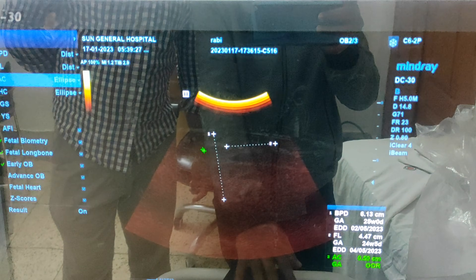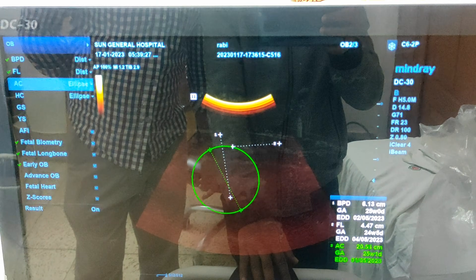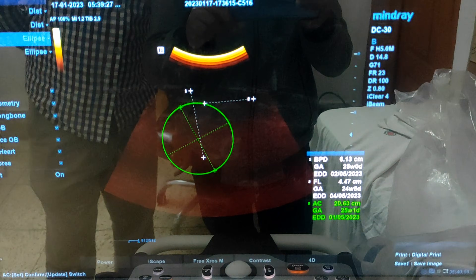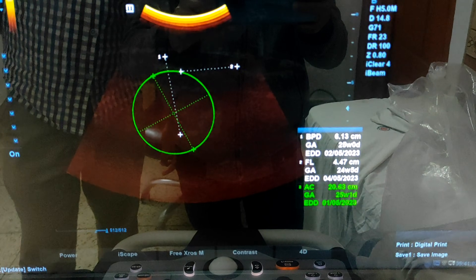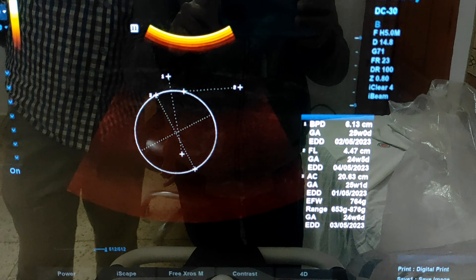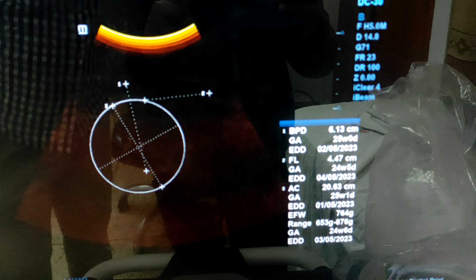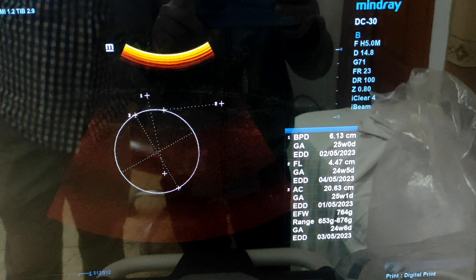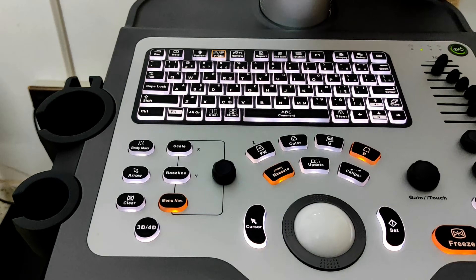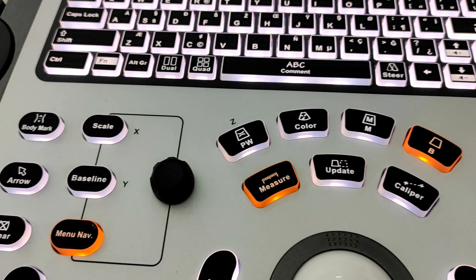Now I am selecting AC, that means abdominal circumference. Click one point here and another point here, then click set. But it is not showing the expected fetal weight. To see the expected fetal weight, just double click on your set button. This time it is showing expected fetal weight — 764 grams. The key thing with Mindray DC30 is you have to click the set button two times to get the expected fetal weight.